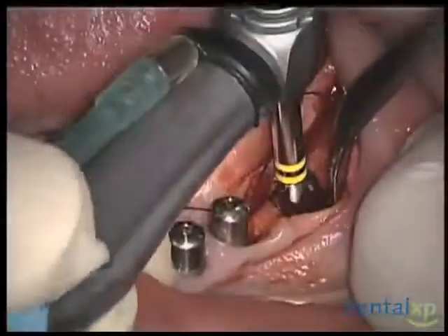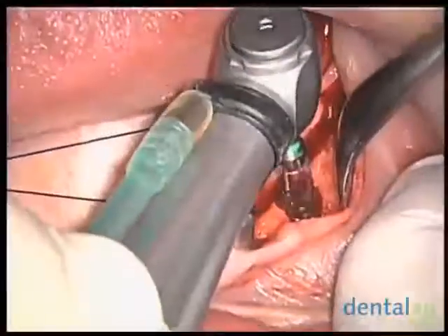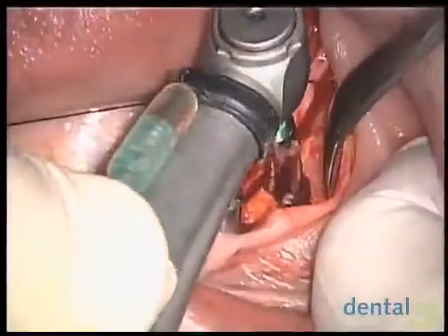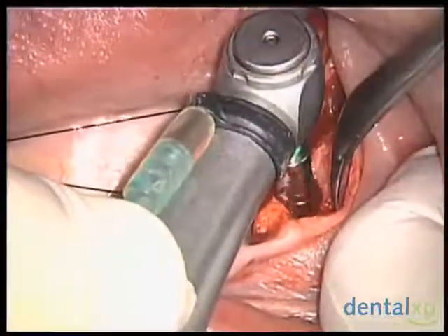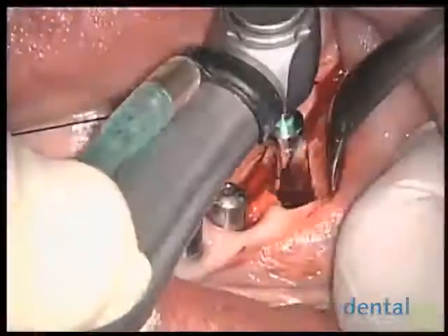Another of the advantages of this BTI low speed technique is that it will give you very precise control on the depth of the osteotomy. As well, we will be extremely precise on the angulation of the osteotomy.